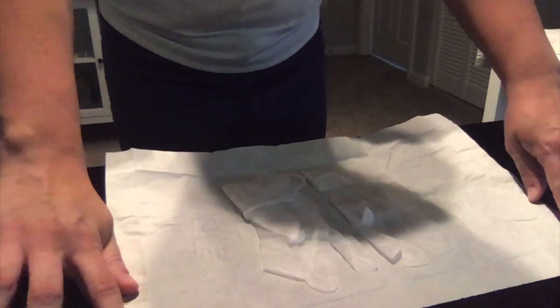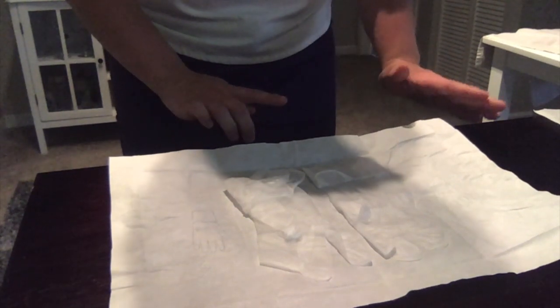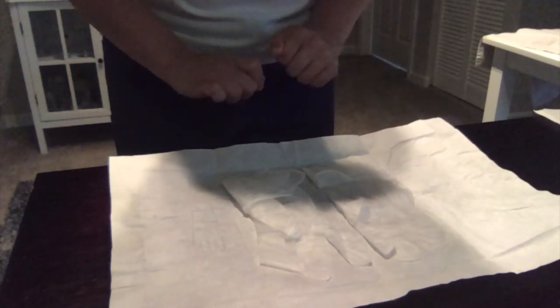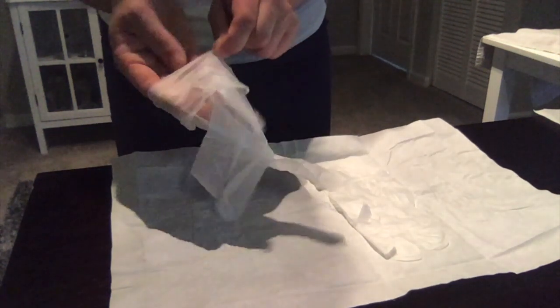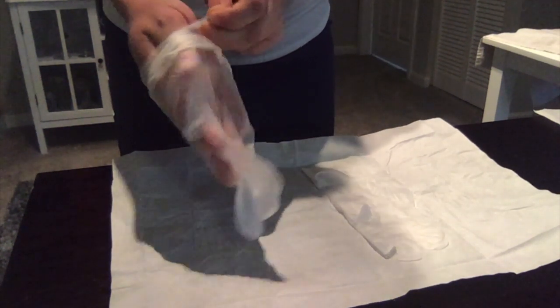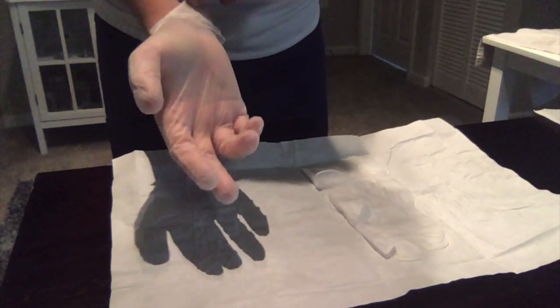And then I go ahead and flatten it by only touching the 1 inch border around the gloves. I'm also making sure that I'm far away from my other sterile field that I have. So I'm going to do the right hand first. I'm going to put this in there like that, only grabbing the cuff that's flipped over. I'm not grabbing the glove at all. Okay, so I'm grabbing the inside cuff so it still maintains the sterility.